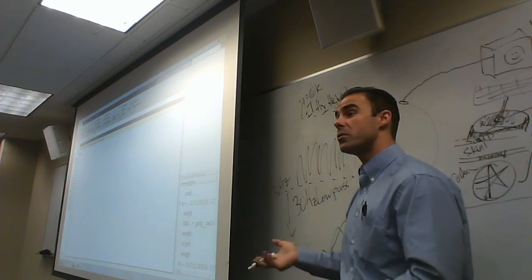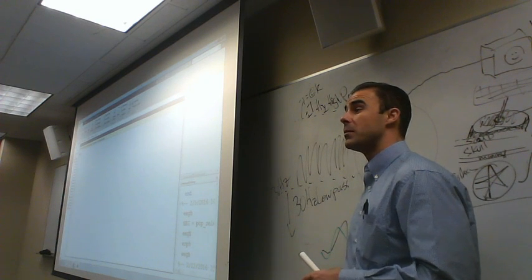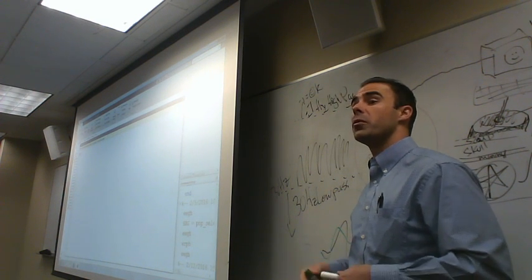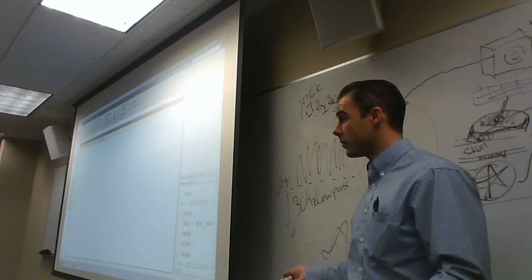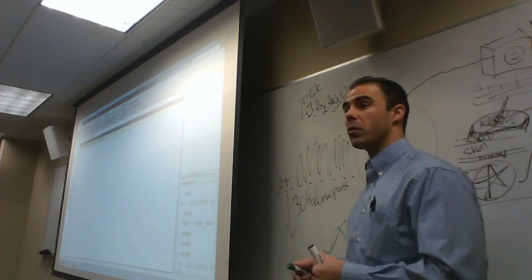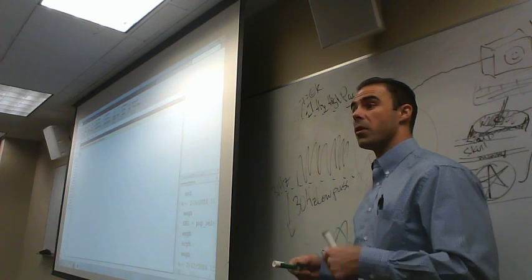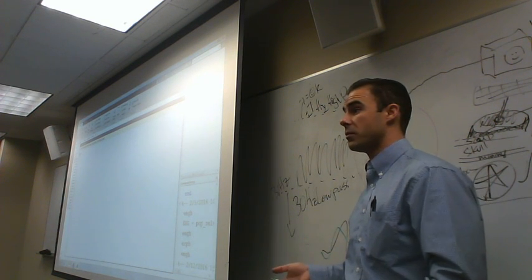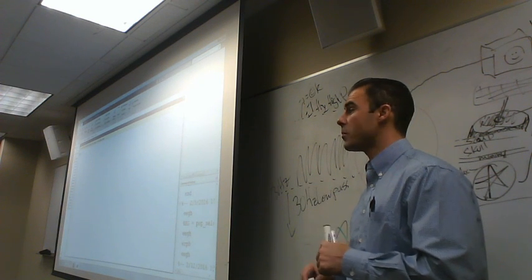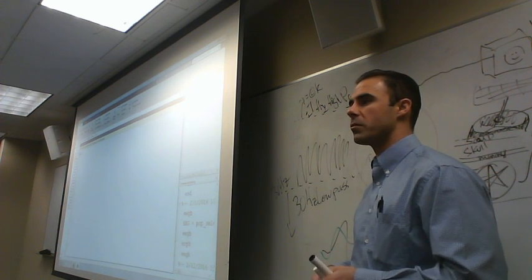So it's possible that you can change your data and sometimes eliminate effects or create fake effects if you filter too much or filter in the wrong way. So we're not going to belabor that point anymore, other than it is important to know that point of caution, know what the limitations of filtering are, and revisit that chapter in Luck's discussion about it, because it'll help clarify some more details for you.